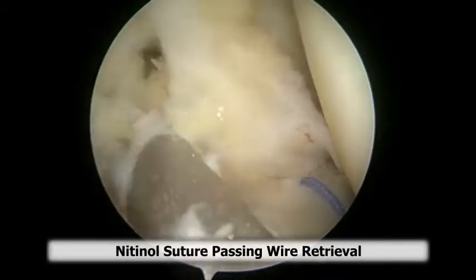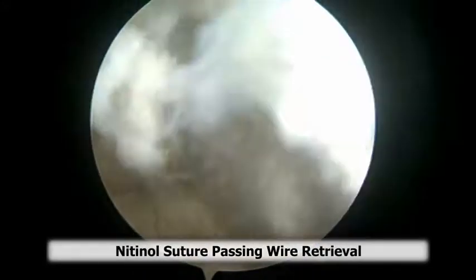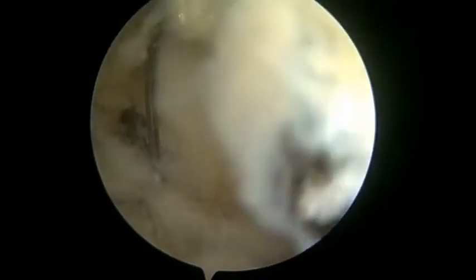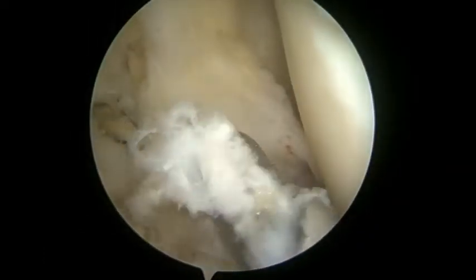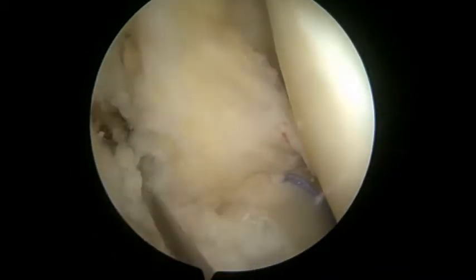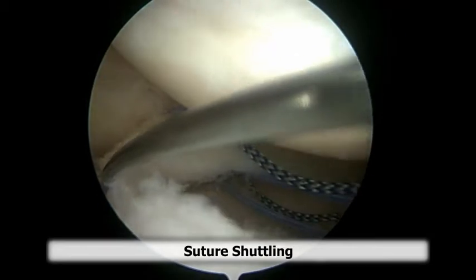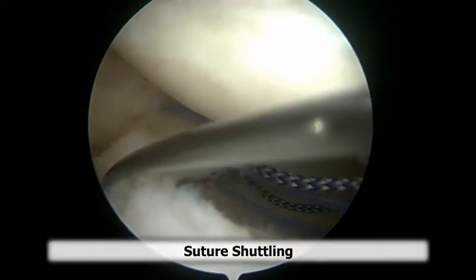We then used a nitinol suture passer to retrieve the sutures through the tibia. We placed the nitinol suture passer up through the tibial socket and retrieved it using a looped grasper through the medial portal. The sutures were then shuttled back through the tibia in standard fashion.